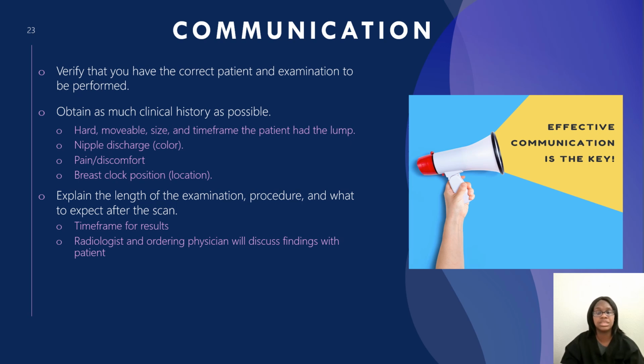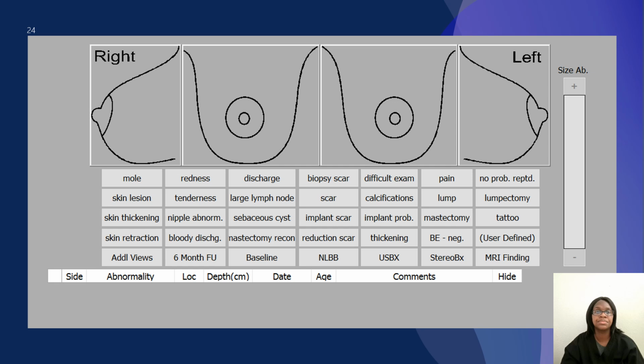So you always want to just document these notes. And even the technologists that could be performing the scan for the next year, they will get an idea of where this area is located. And then this is just an example of how you can chart if you are using a computer, and you may recognize this charting system.